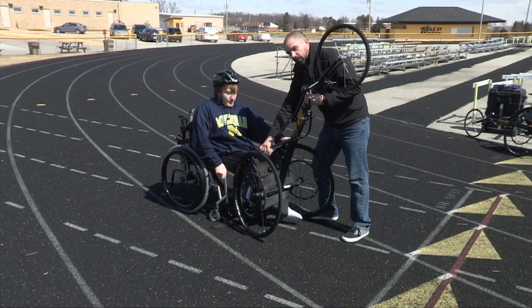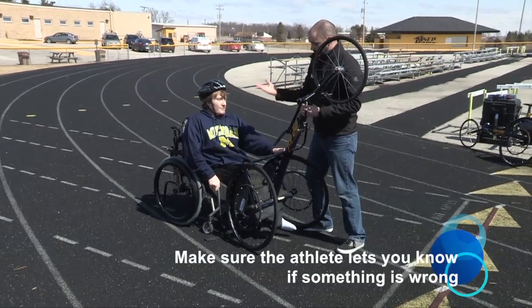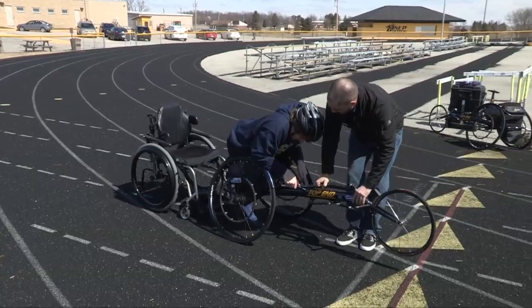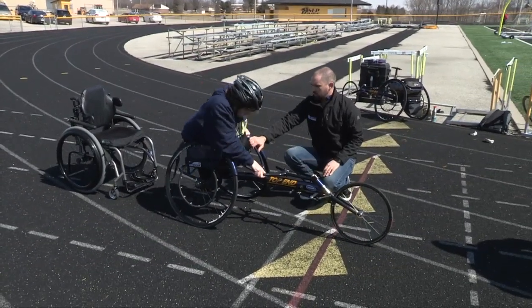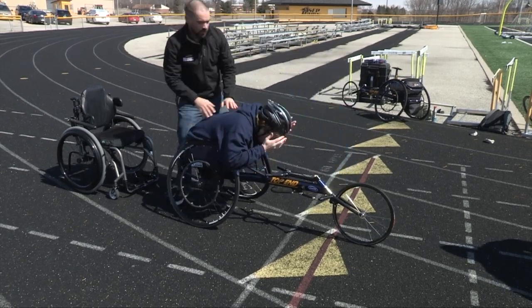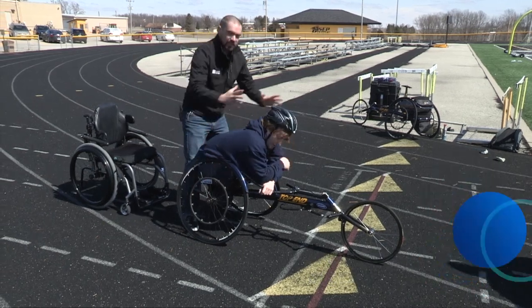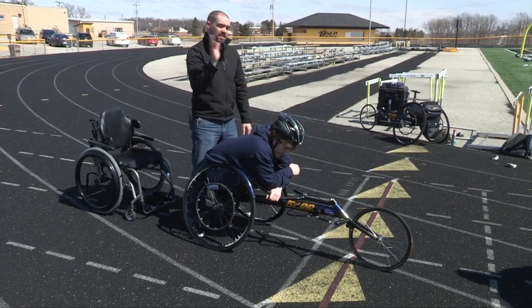Jordan's going to hold onto the frame as we bring him forward. We're going to tell him if we're doing something wrong or something's not going right. We're going to go and bring him down slowly, he'll transfer his weight over. Brings his knees up, gets positioned correctly. Once he's there, we want to make sure he's strapped in. I let him go here because all of his weight is forward. We want to make sure that his mass is in front of the center of gravity, which is the axle. If I let go of him before he does that, he's going to tilt backwards.